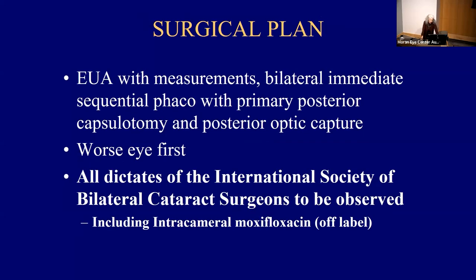So the surgical plan is, needless to say, exam under anesthesia, and we make measurements right away, and we talk at length to the family, because if this man didn't get brought in for his cataract until he couldn't find his food, do you think he'll ever be brought in for his YAG capsulotomy? I rather doubt it.